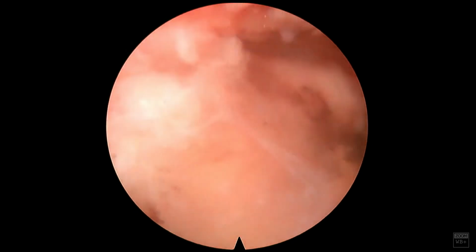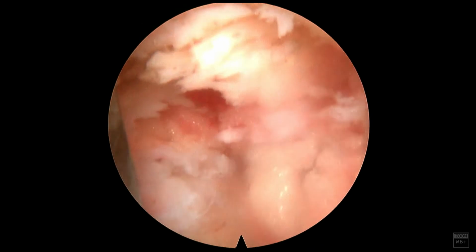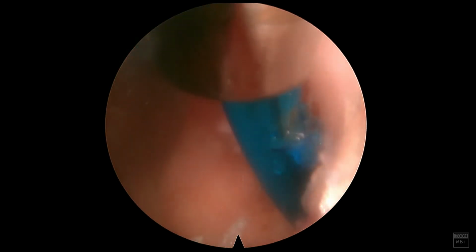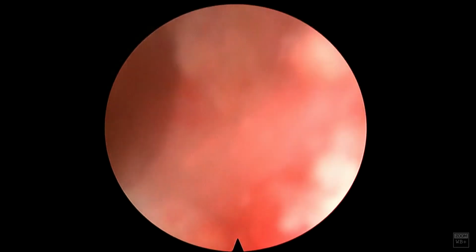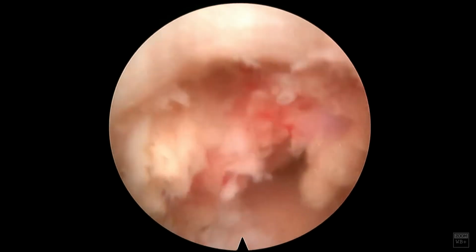So what I'll do is take the bipolar probe and probe around here. What I had done is I had stuck the RF probe too ventrally, and if you know from open procedures, that's not good, because that's where you get into those really brisk bleeders. Eventually I was able to control it, sticking the RF probe down in there, and you want to really hold it over what's bleeding too. I know that seems a little bit intuitive, but sometimes it's not when you're actually doing this in a person. Even some of these bleeders from this epidural fat can really get you, so it's really important to get those too.